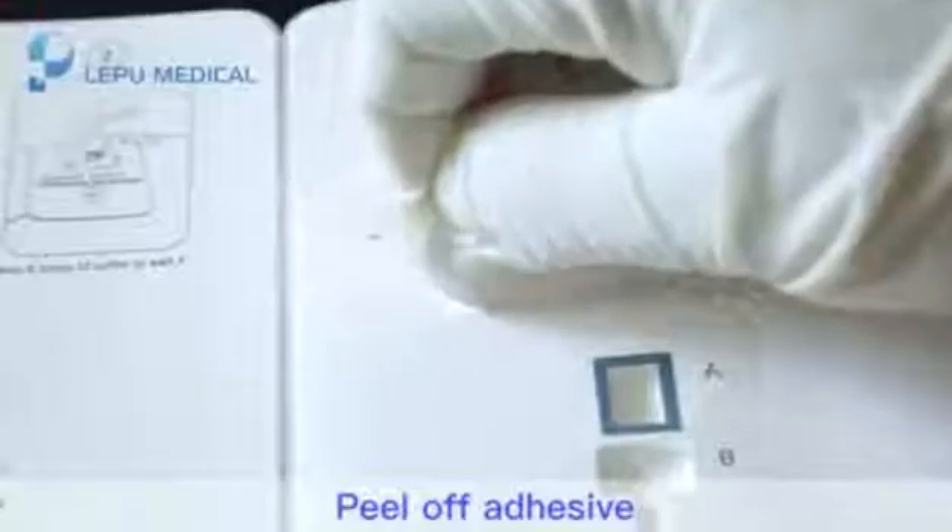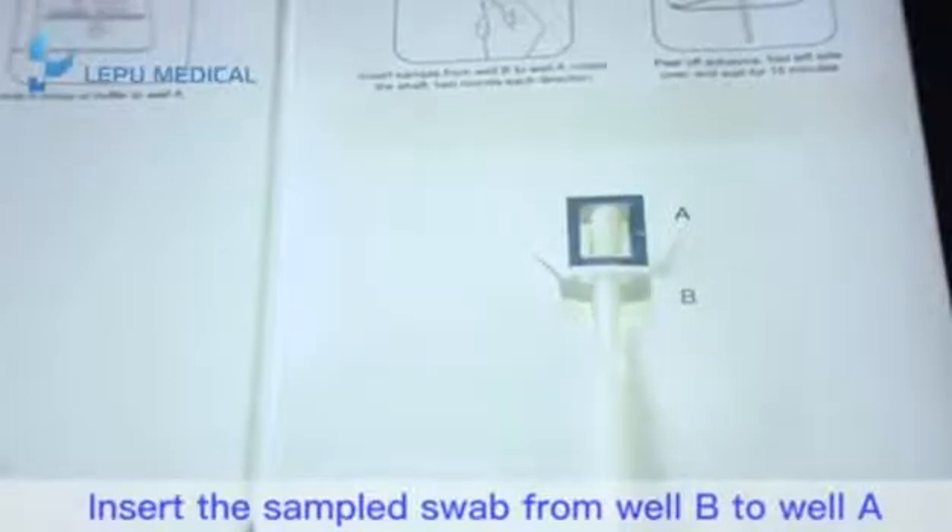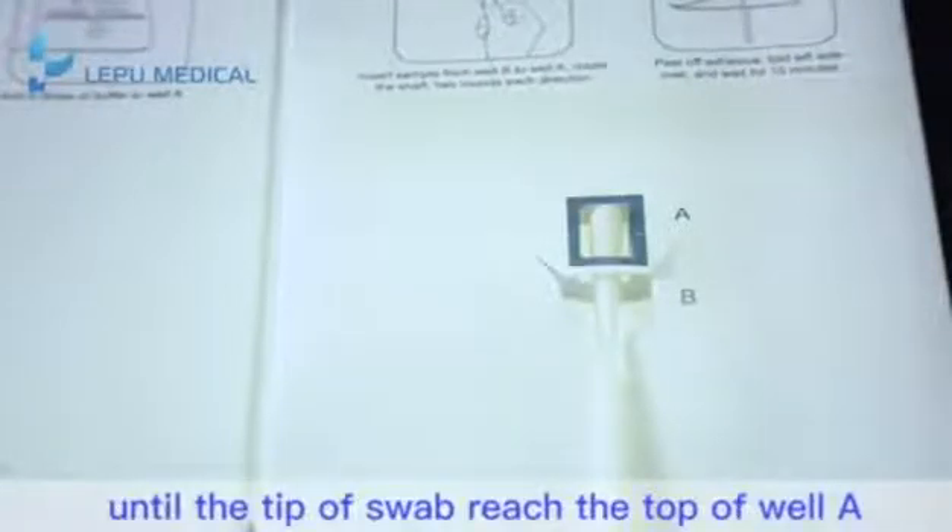Step 4: Peel up the adhesive. Insert the sample swab from well B to well A until the tip of the swab reaches the top of well A.